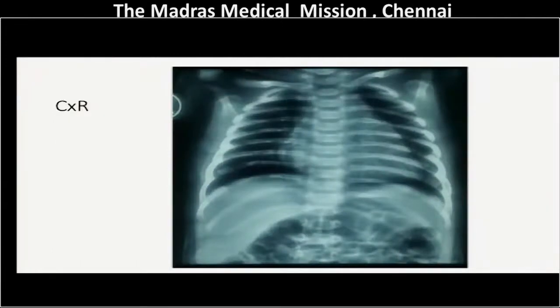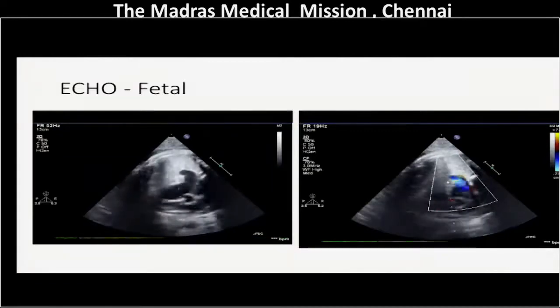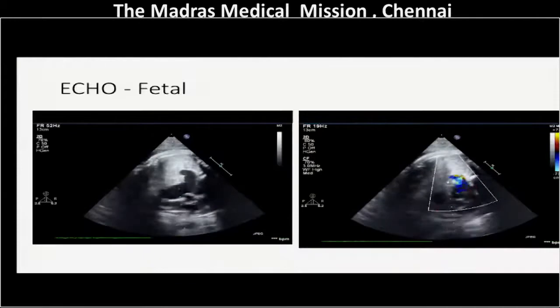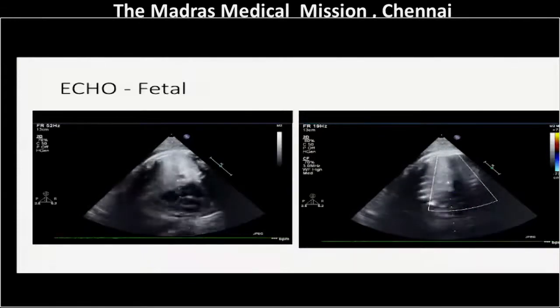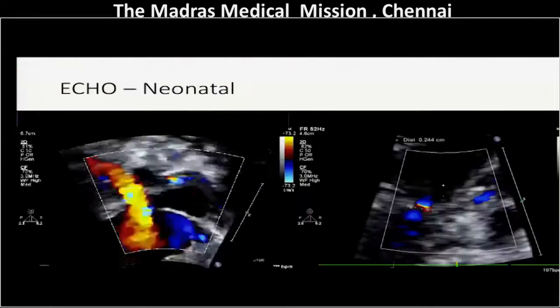Chest X-ray showed situs solitus levocardia with a cardiothoracic ratio of about 55% with pulmonary oligemia. A fetal echo demonstrated a dilated aneurysmal-like sac that drains into the roof of the LA. Color flow Doppler shows a fistula drainage into the roof of the LA. A gradient across this fistula was about 68 millimeters of mercury.